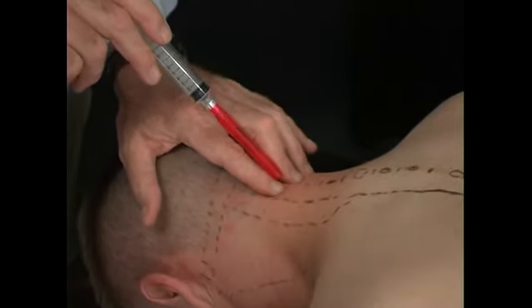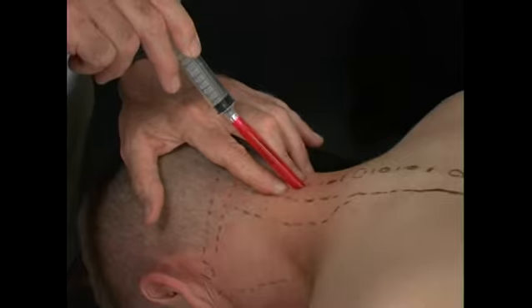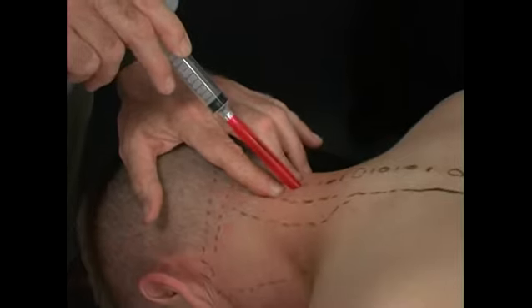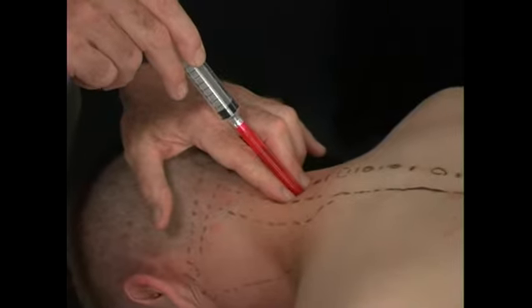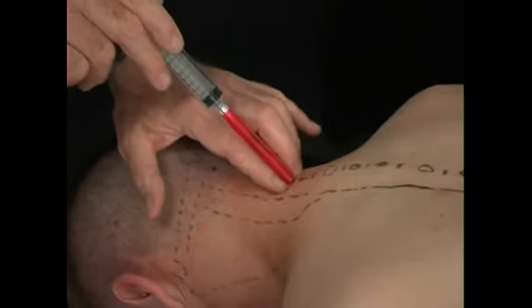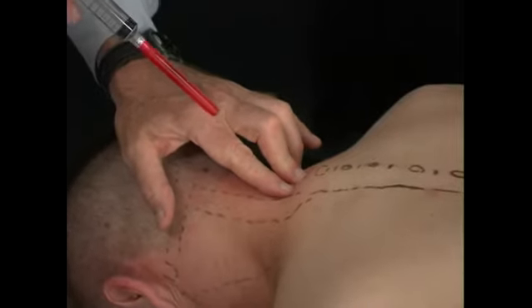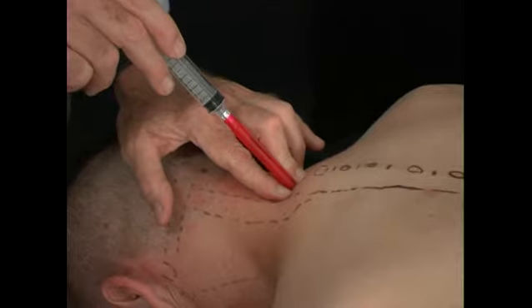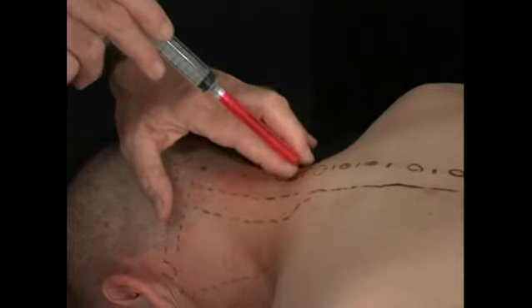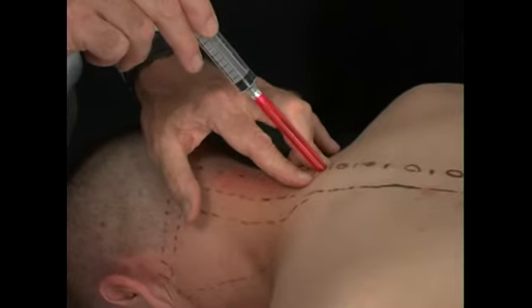So you come out to the skin level, slide the skin down, and go back in between the spinous processes into the interspinous area. We then come back out and move on down to our next spinous process, and repeat that procedure, moving down gradually with our fingers locked. Again, skin compression, so we're moving the skin in and hitting the spinous process, the interspinous area, the spinous process.